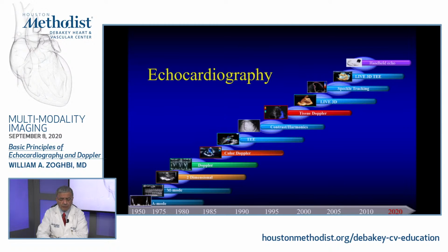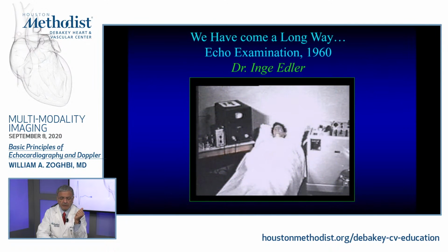Really quite an evolution, based still on the same principle of sending ultrasound waves and processing whatever is reflected from the object, taken up by the transducer because it excites the transducer, and then go back and process this, with all the computerized technology.